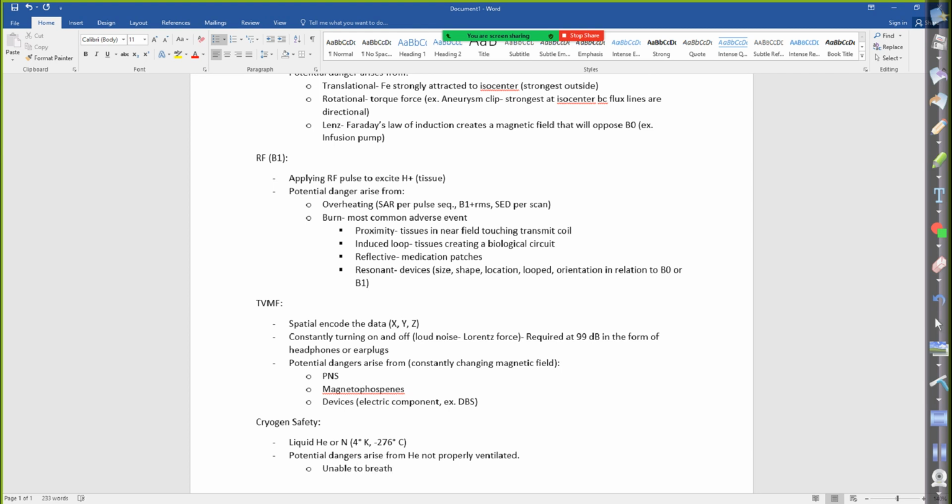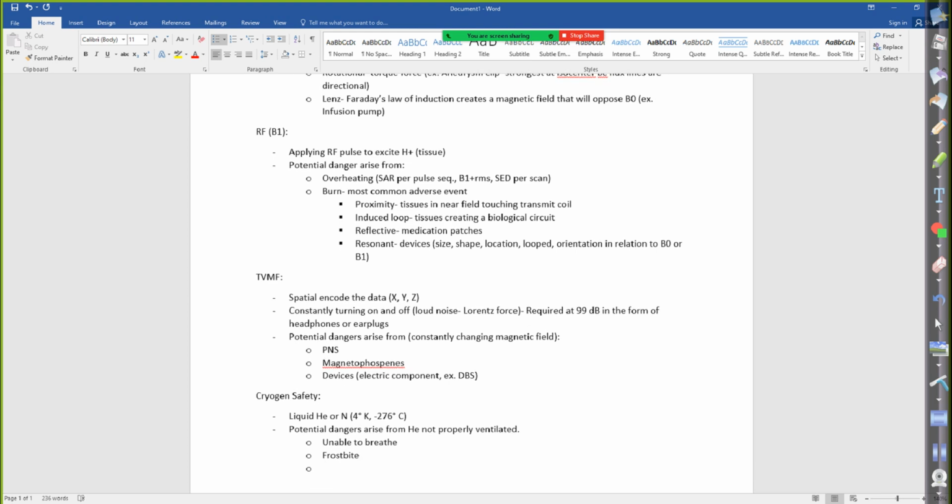Okay. Frostbite. What else? Combustion, right? Combustion. All right. Fire. Yeah, that's the fire with it. What else? Higher pressure. Higher pressure, yeah. It increases, and that could possibly cause tympanic membrane rupture.